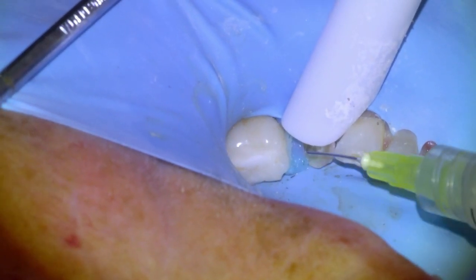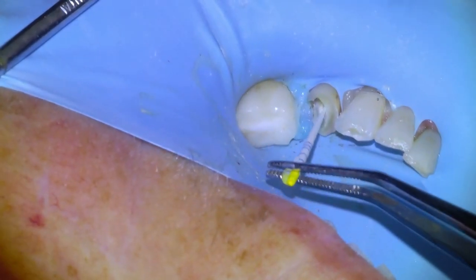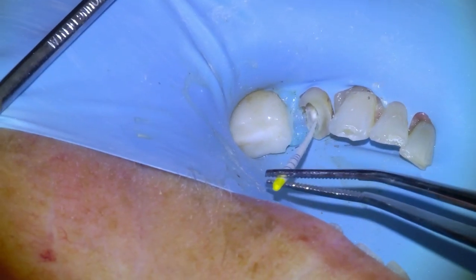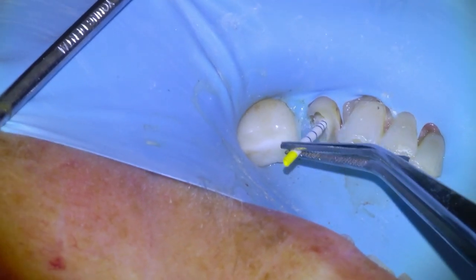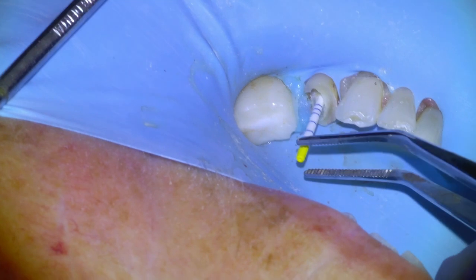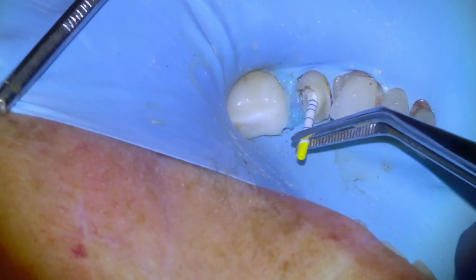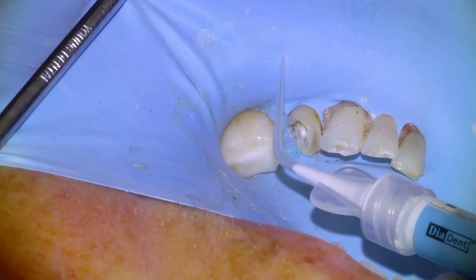Final irrigation and then we're going to begin drying the canal with paper points. I'll usually use F1 paper points to dry, usually one or two sizes smaller than the master file, to ensure that we have all of the hypochlorite out of the canal. A second paper point comes out mostly dry, and that one is fully dry.